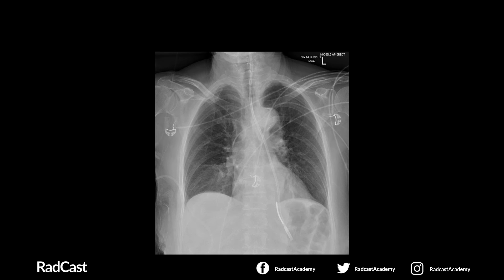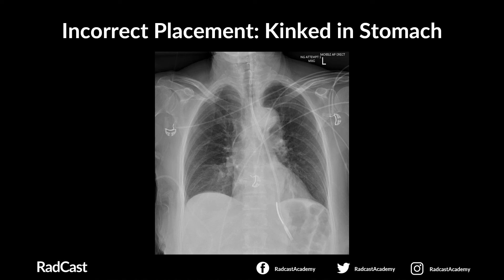With the next chest x-ray, after confirming patient and viewing field: step one, is the NG descending in the midline? Yes. Step two, is it bisecting the carina? Yes. Step three, is it crossing the diaphragm in the midline? Yes. Step four, is the tip clearly visible below the left hemidiaphragm? No — the tip is kinked back on itself and sits at the level of the left hemidiaphragm. This is an incorrectly placed NG tube kinked in the stomach, and using it would put the patient at risk of aspiration or reflux. It is not safe to use.